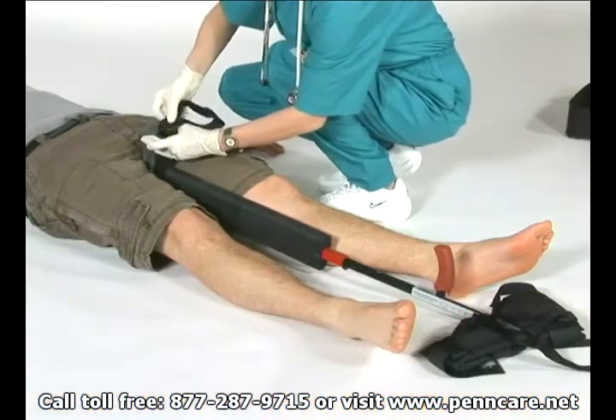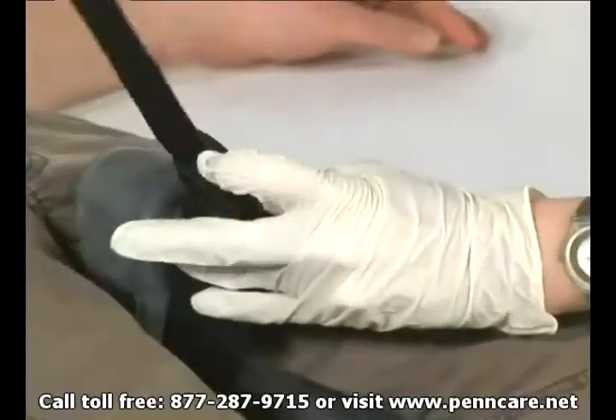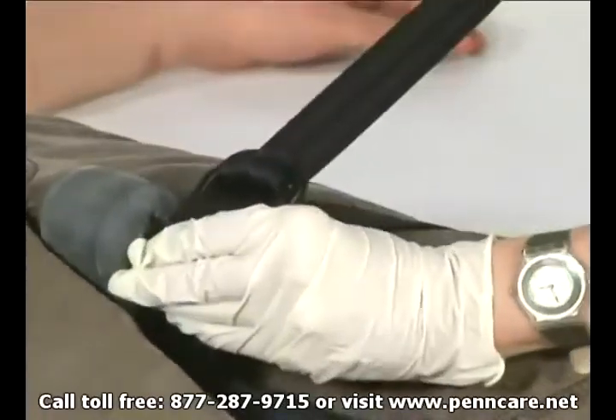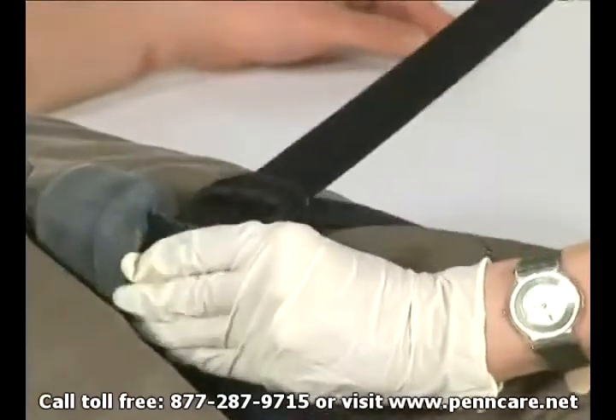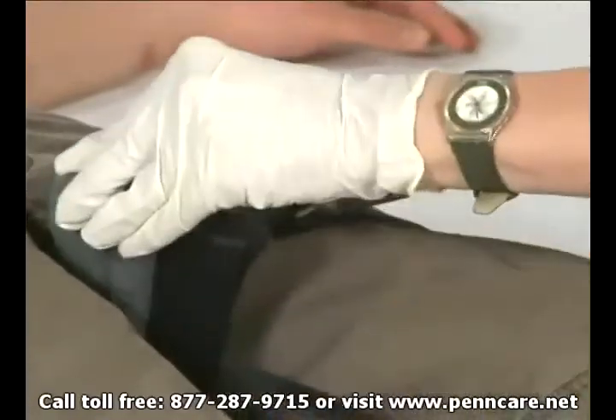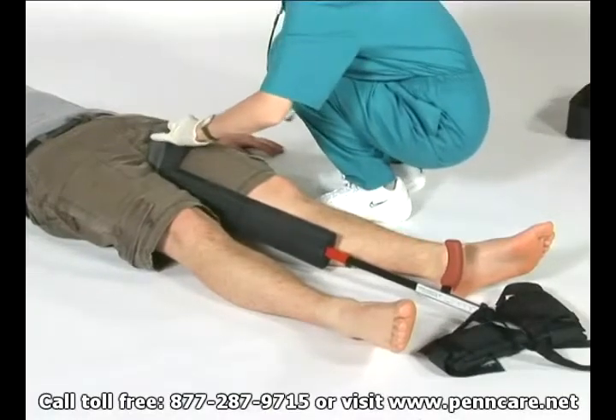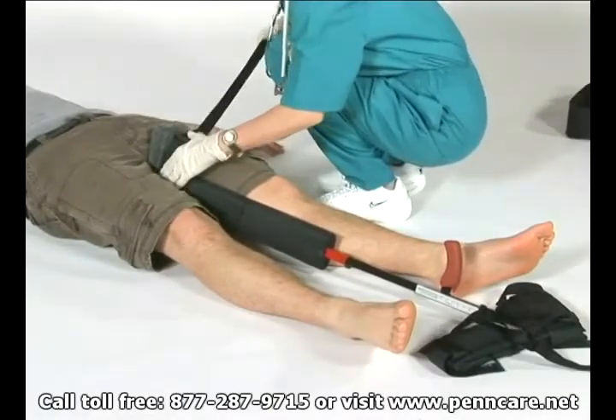Apply the abductor bridle or thigh strap around the upper thigh of the fractured limb. Push the ischial perineal cushion gently down while at the same time pulling the thigh strap laterally under the patient's thigh. This will seat the lower end of the cushion comfortably against the ischial tuberosity. Tighten the thigh strap lightly.